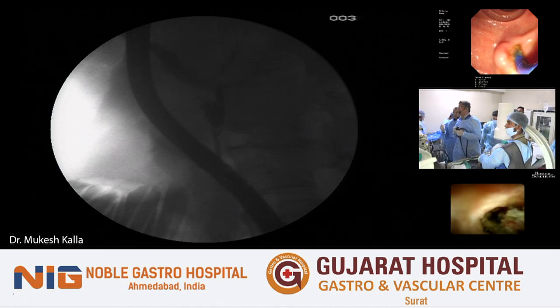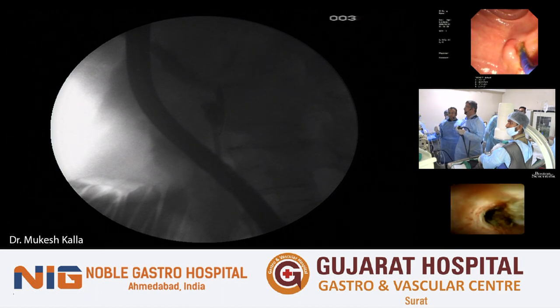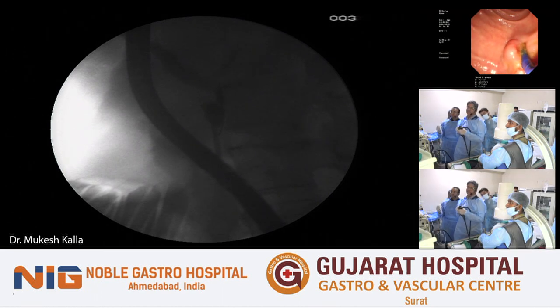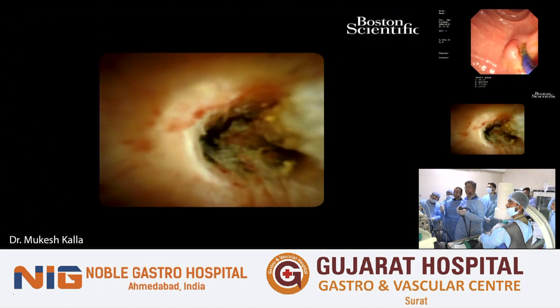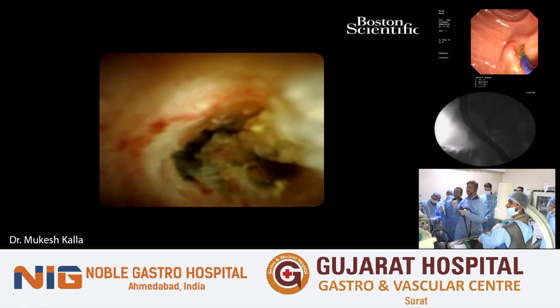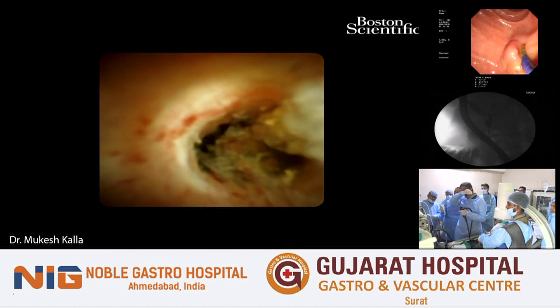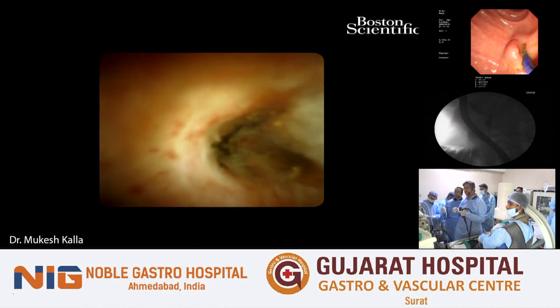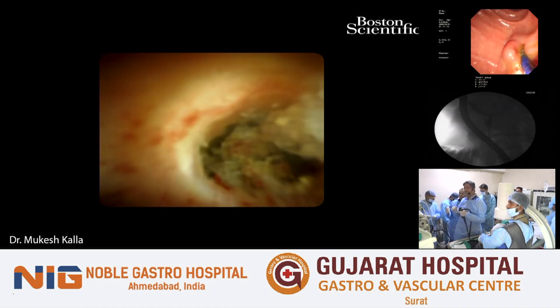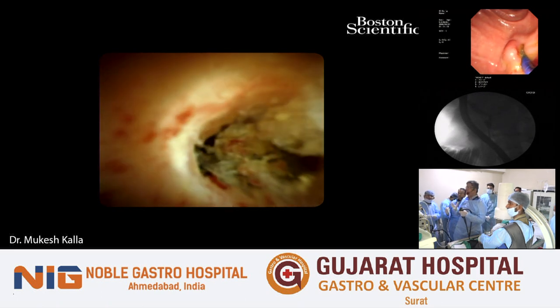Your question is to change a technique for intubation. Now see, my intention was telling you that we should have a good sphincteroplasty and a wide open ampulla, because I don't want to put any pressure on the bending section. We did struggle a little bit at the ampulla, and I had to use the elevator. Since I had to use the elevator, this is what I don't want. So if possible, you should always try to have a sphincteroplasty when you are dealing with a big stone.